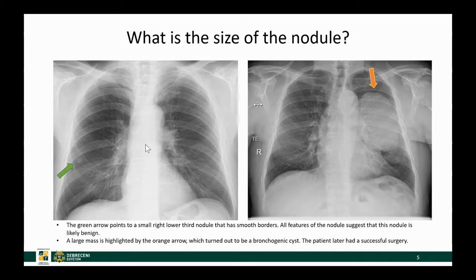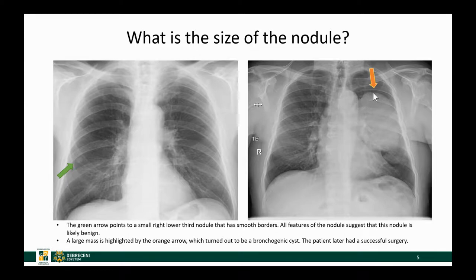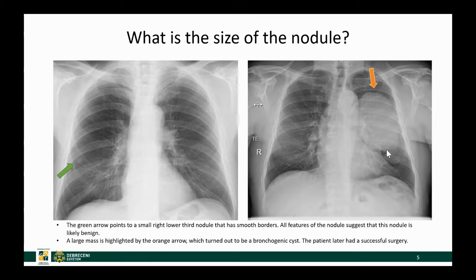With x-ray we can also report on the size of the nodule. As a reminder, smaller than 3 cm is a nodule; larger than 3 cm is a mass. Here you can see a smaller nodule with smooth borders — probably benign — and a mass in the left lung which, even though it's quite homogeneous with smooth borders, requires further characterization with CT based on its size alone. This patient cannot be sent home; they need a CT. This actually turned out to be a bronchogenic cyst, and after surgery the area cleared up completely on the following chest x-ray.